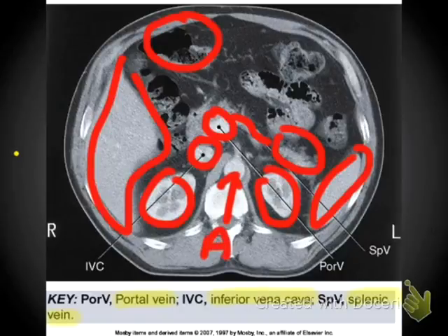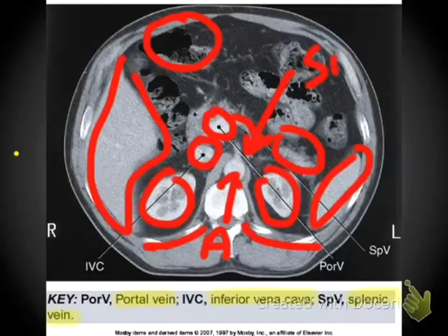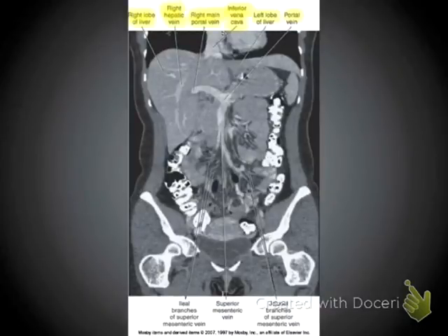And one of the things to look at is we have ribs still coming off here. So we're getting ready to pass probably into L1. This is probably the celiac artery or the SMA. I would probably favor the SMA based on this image. So we're going to say that this is the SMA here that is actually coming off. So this area here is the SMA.